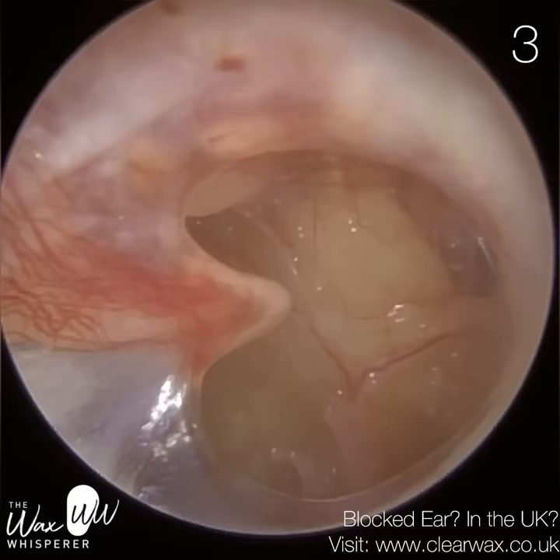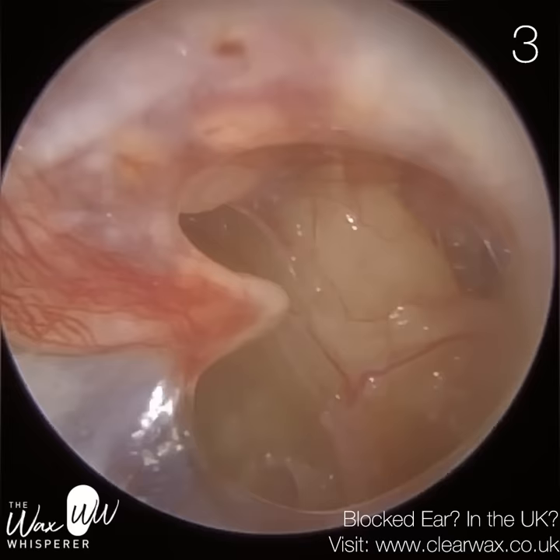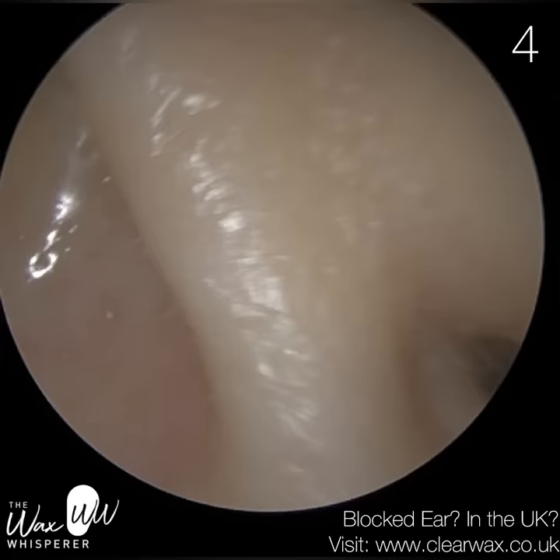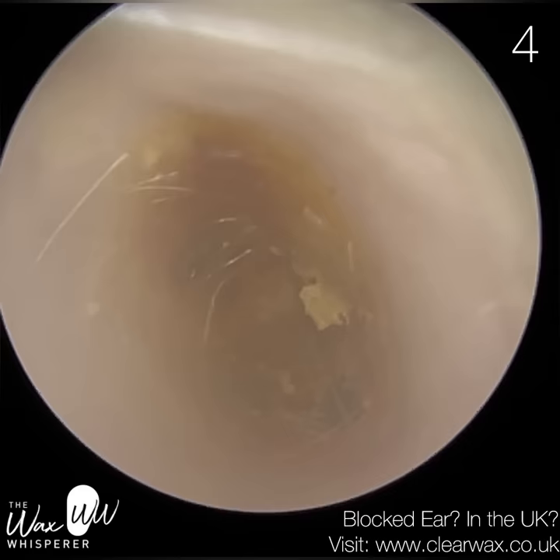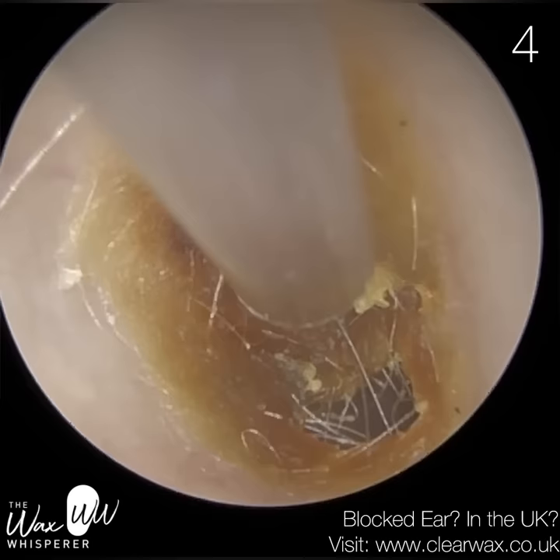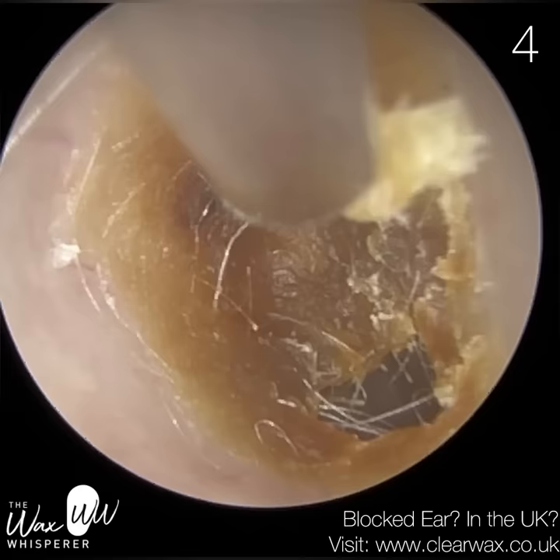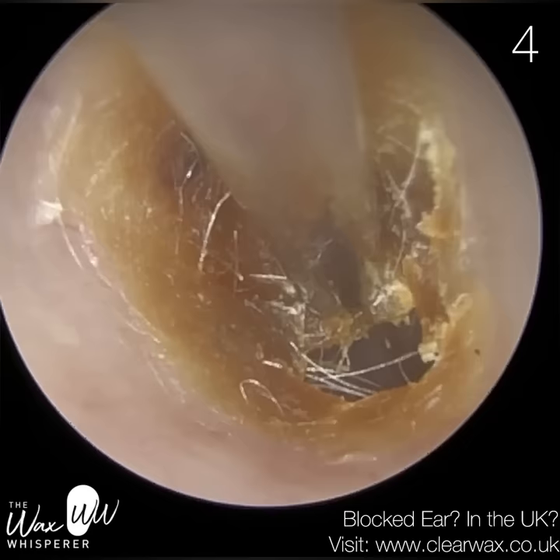On the right-hand side at three o'clock, you can see the round window niche — that's part of the cochlea. There's a bit of mucoid collection in there, and this patient has got a slight infection. In the past, when we've removed the dead skin in the presence of the perforation, they could hear much better, but today they weren't able to. There appears to be some debris sitting on the promontory, which is part of the labyrinth. The labyrinth consists of the organ of hearing — the cochlea — and the semicircular canals. It's all interconnected and just seems a bit damp on the surface.